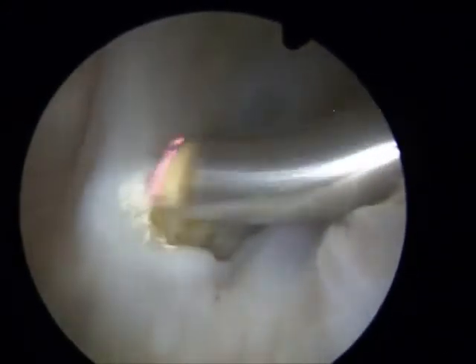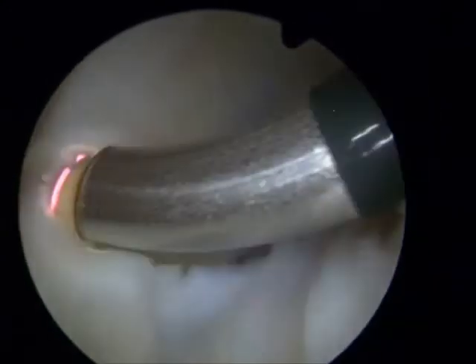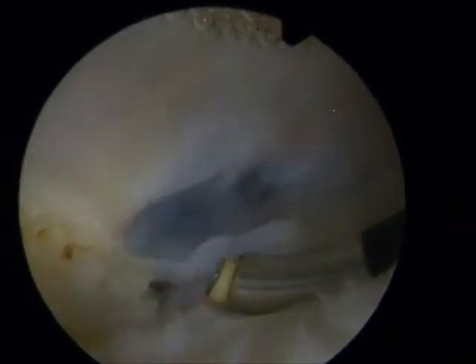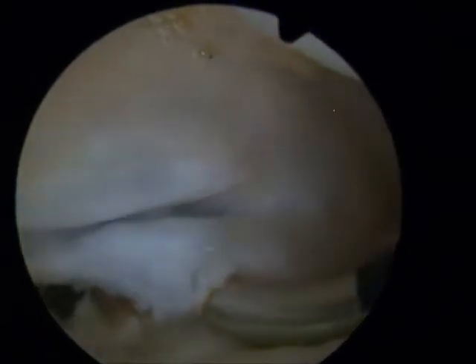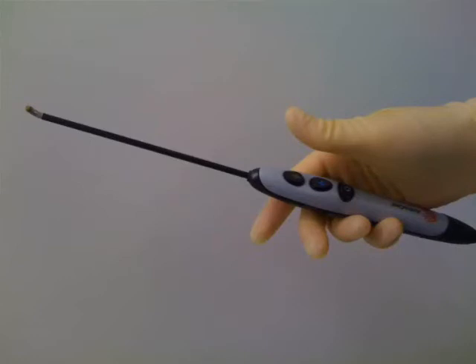The other thing I'm going to show you today is the SupraMultivac 50. This is the new Ambient SupraMultivac wand — it's a radiofrequency wand. If you tried to put a shaver up against this tissue, you'd find it very hard going, very difficult, when it's distended like this with fluid in the knee joint. The other problem with the shaver is it's quite hard to control how much tissue gets sucked into it. It is a useful tool — very good at volume removal once you've got control of the situation, and this Ambient SupraMultivac allows you to do that.